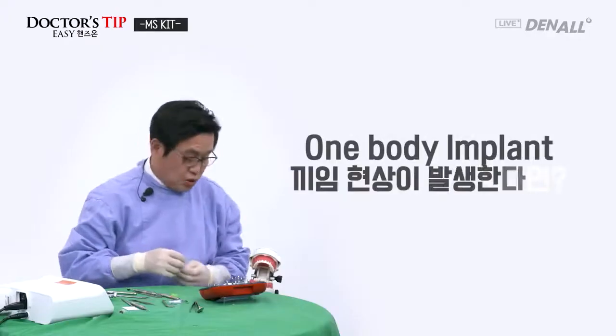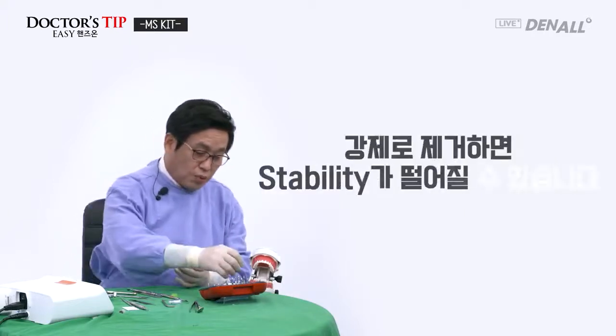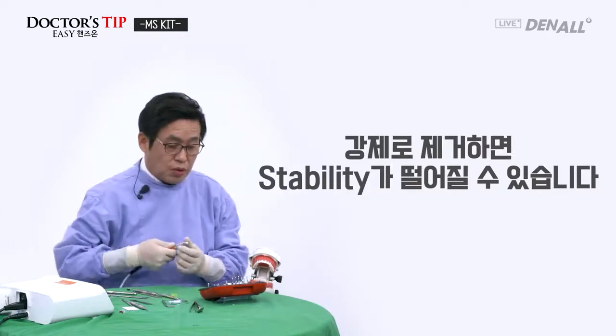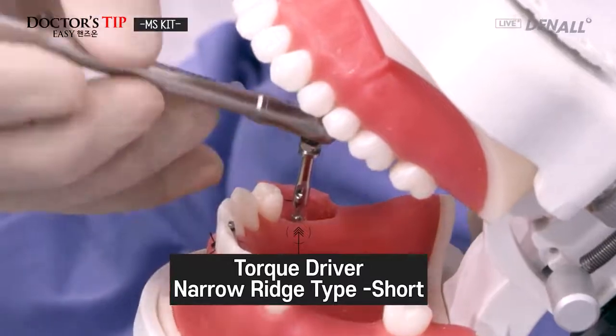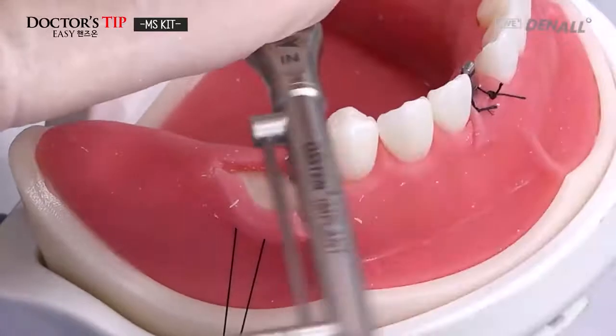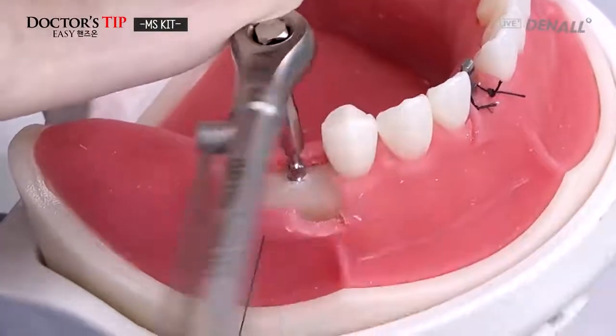Because it's a one body implant, if there's jamming and you force it out, you will lose stability. So you have to be careful. Depth adjustment. So depth is adjusted.